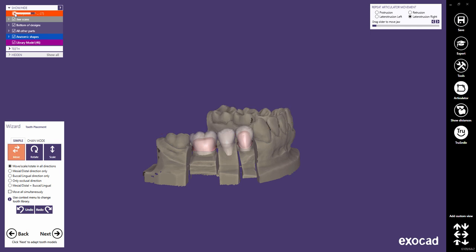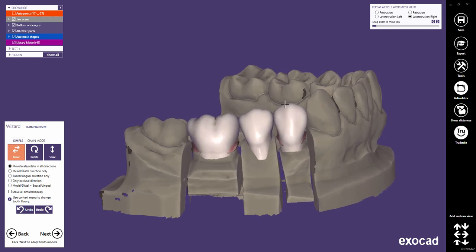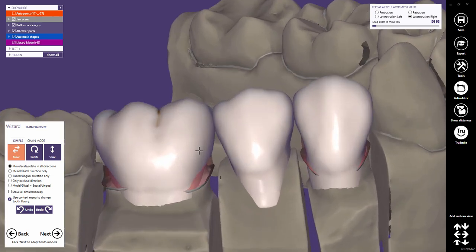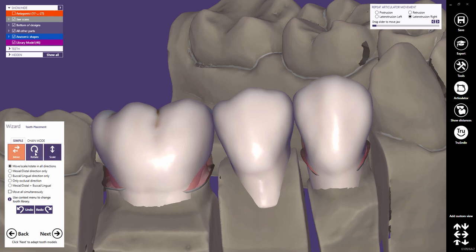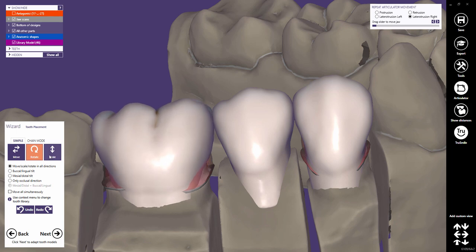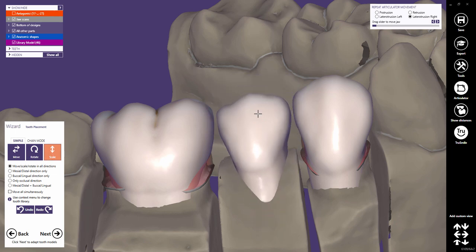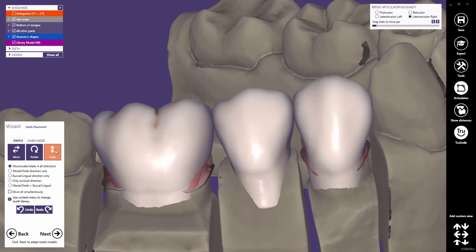In this step, you can optimize the tooth model placement by moving, rotating, and scaling the teeth. The default operation is Move — move the tooth freely in all directions by holding and dragging the left mouse button. Click Rotate to rotate the tooth in all directions, and Click Scale to scale the tooth in all dimensions by holding and dragging the left mouse button. All transformations — moving, rotating, and scaling — can be restricted to certain directions.